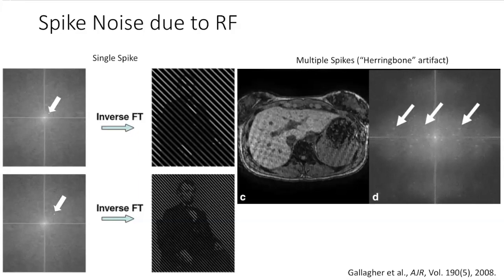Yeah. So I think there's another follow-up question, but for the sake of time, we should move on and suggest that people can easily calculate Fourier transforms in MATLAB, like with fft2 or fftn, and just feel free to play around and see if you can figure out some of these different features yourself in different images. Yeah, and I'll also have my email at the end of this. So if you have any follow-up questions, feel free to email me, and I'll email you back and hopefully point you in the right direction to get more information about this.